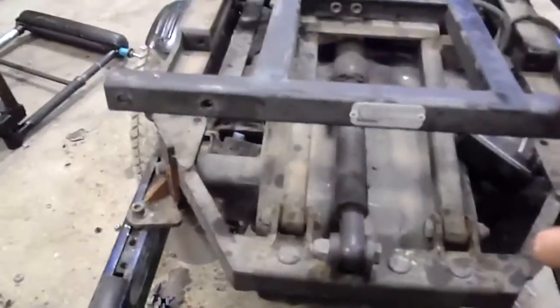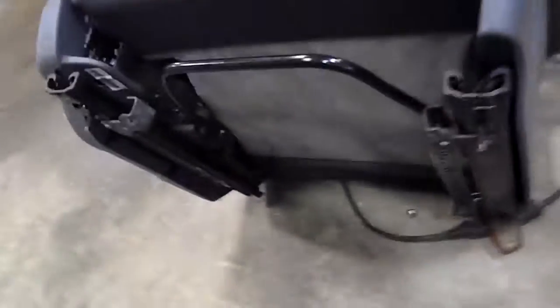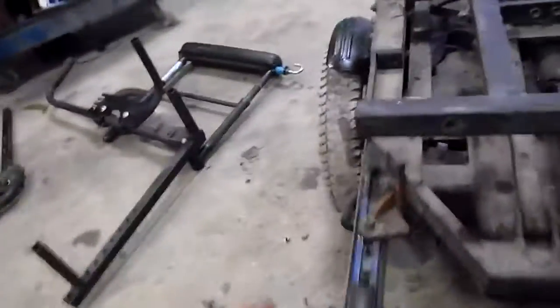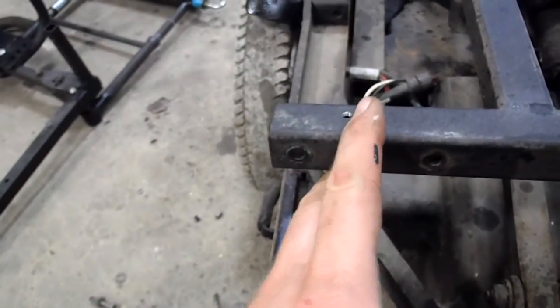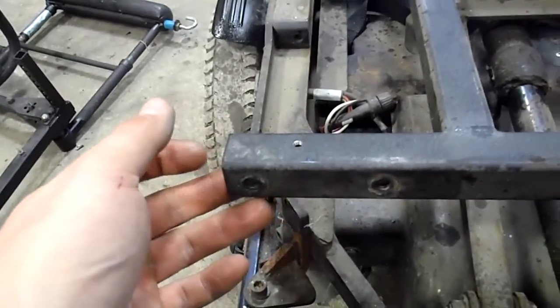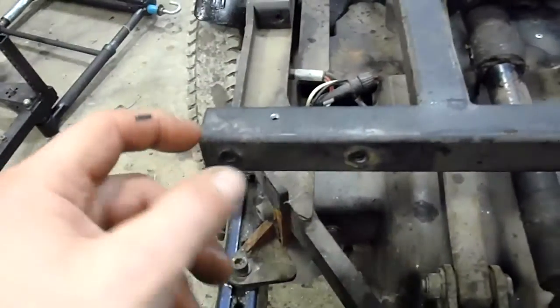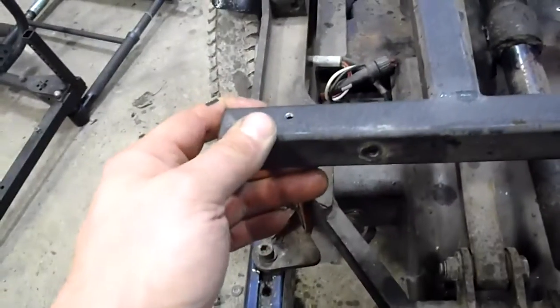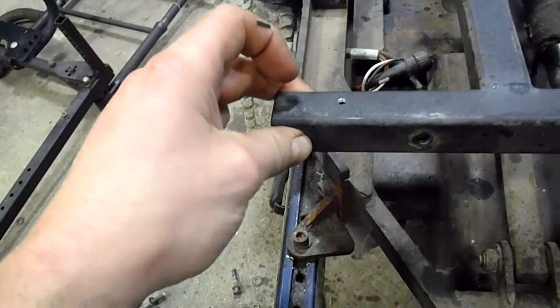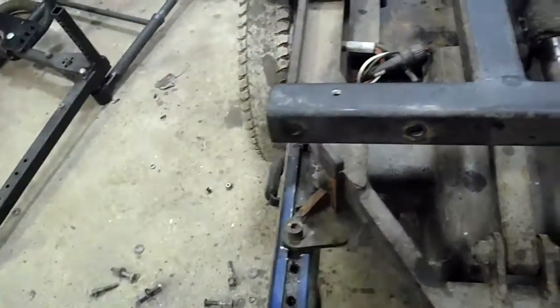But anyways, I'll get this sitting flat, and then I'm going to try to put the seat tracks, these, in if possible. I want those tracks. I'll have to be careful because they slide in and out, but I'd like to have them sitting right down in here to give myself another, whatever this is, 3/4 of an inch of tube steel. I'll make sure that I don't drill any holes through this, so that my side to side adjustment on the factory armrests isn't affected by it. And instead of bolting these, I might just get a trailer hitch pin type thing put in there, so you can just pop it out and slide them in and out.